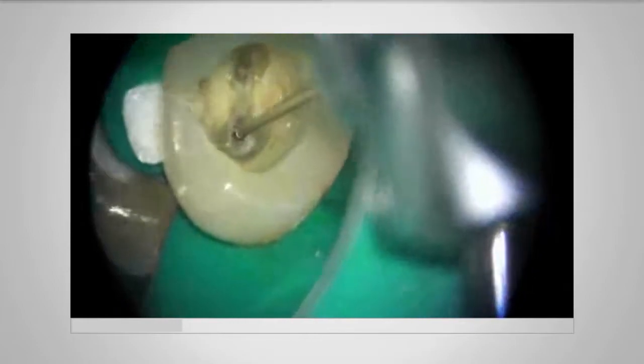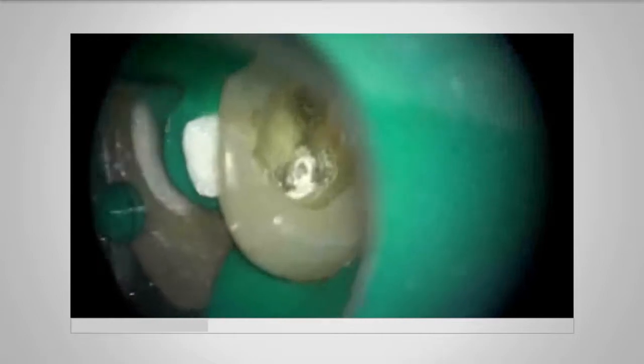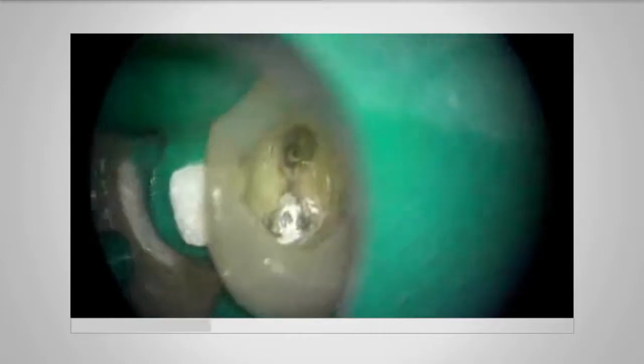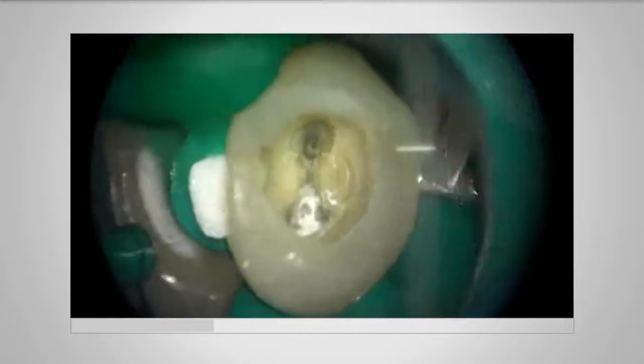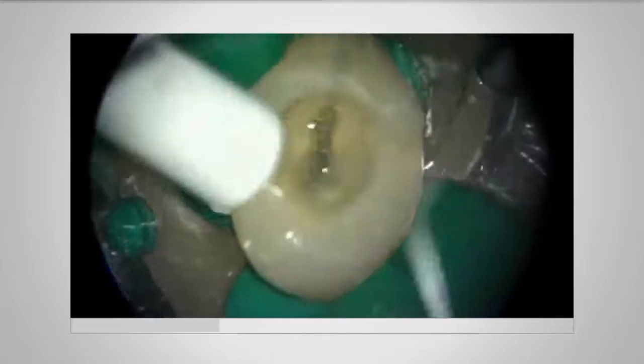So I've picked up a small sized LN burr because the canal isn't patent. And I'm now going to remove calcified material from the coronal aspect of that orifice. You often find that the constriction is more coronal. Once you've removed that by coronal flaring, then you can progress apically very quickly. So then rinsing again with sodium hypochlorite.